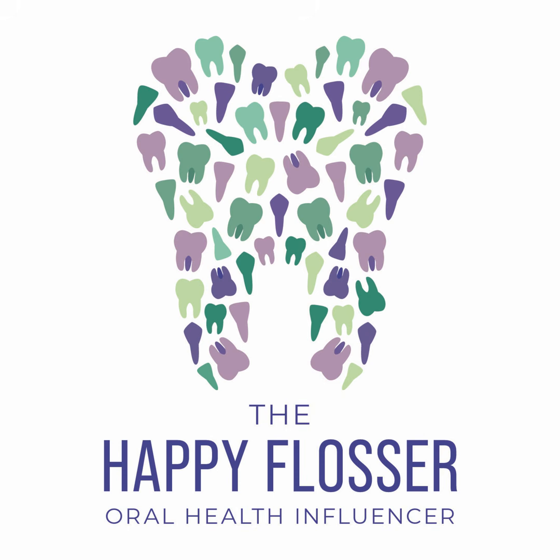As soon as you get it out of the patient's mouth, the first thing we want to do as clinicians is look at the impression. But can I just ask you to take care of your patient first? They may have alginate impression all over their face, or they may just need a napkin or something to wipe off their lips, or maybe they just want to spit or something. Whatever you need to do to take care of your patient first. And then after you've taken care of your patient, then you can inspect your tray and check to see if you have an acceptable impression, right?